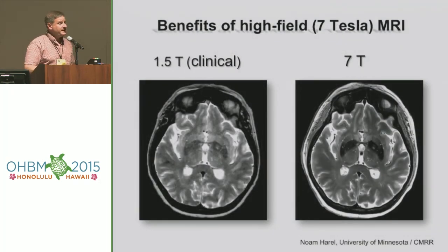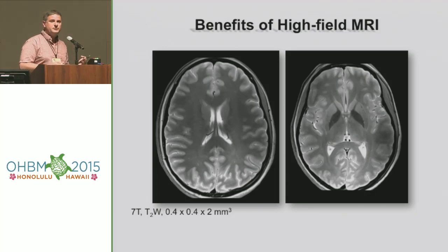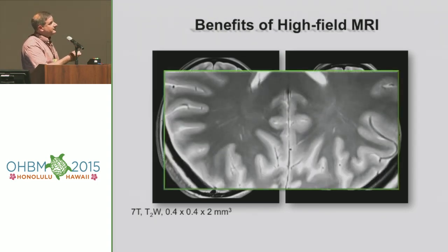This is the exact same patient that was scanned on a 1.5 and on a 7 Tesla. And you can clearly see the differences between the two images. It's not only that you can see better features or a cleaner image, but you can extract more information. So the beauty is not matching the 1.5, but pushing the resolution, because you have much more SNR to burn, as we call it, to push the resolution and get smaller and smaller voxels, or more and more information. So you can get very nice information in the white and gray matter, of course, but you can actually get nice information within the gray matter, and you can follow very nicely vessels running in the sulcus.